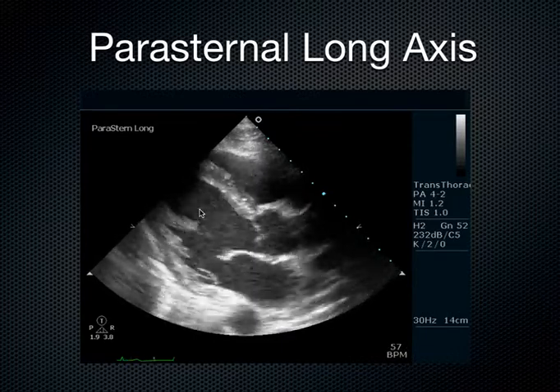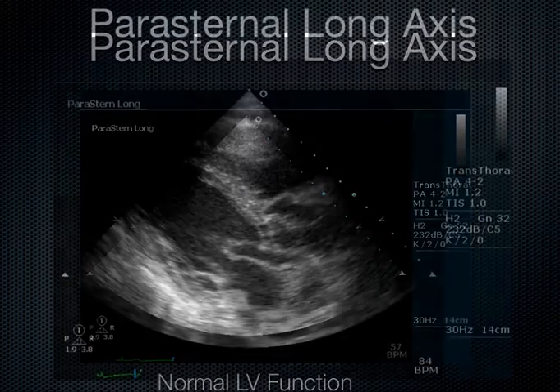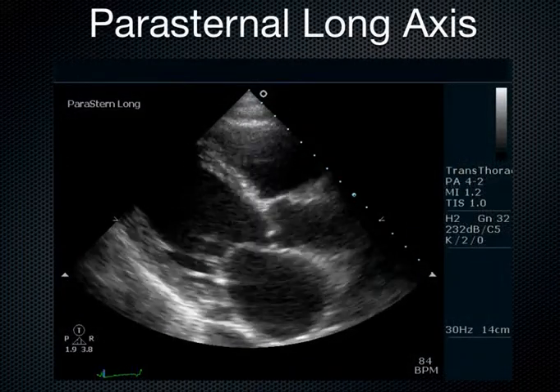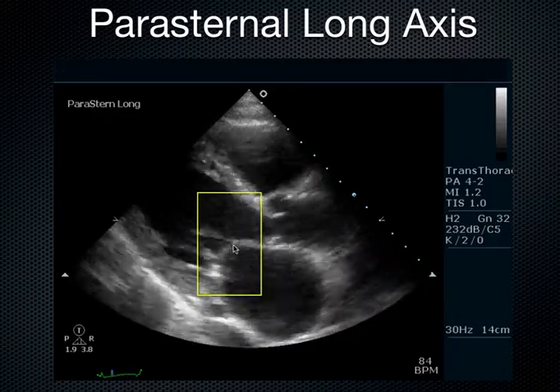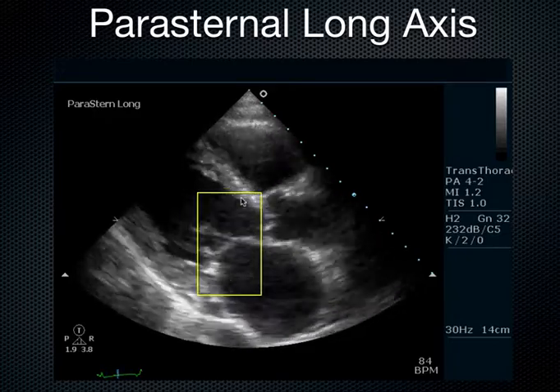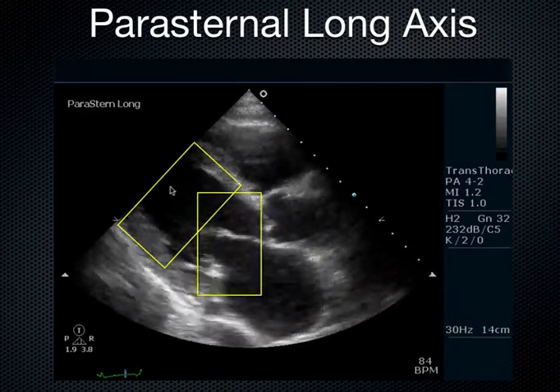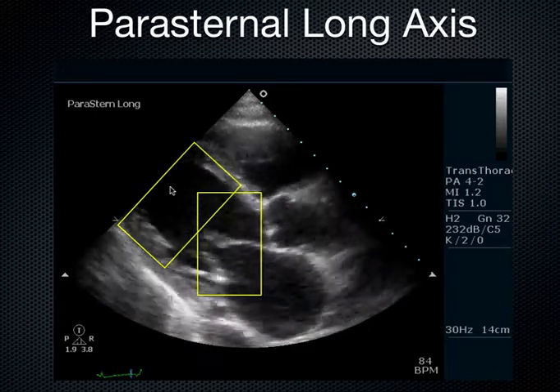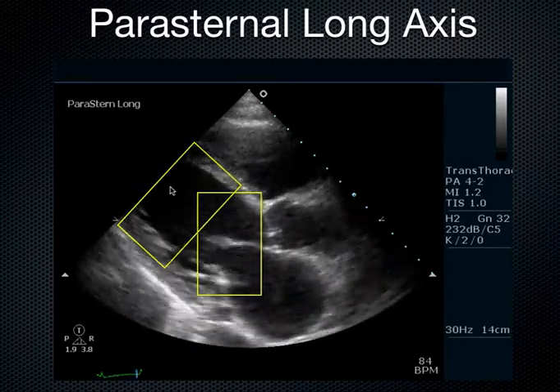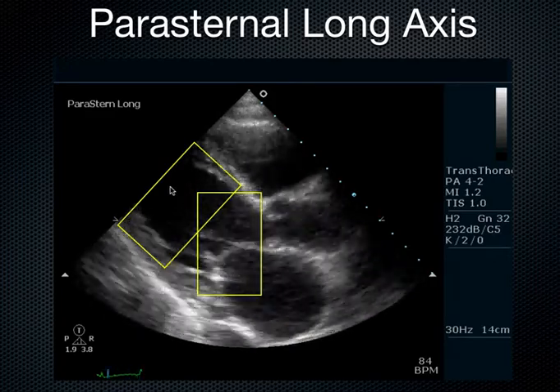So it's easy to put a patient into what we call fluid overload if we don't have a patient with a good functioning heart. Take, for example, this heart. Is the mitral valve coming up and smacking that septum? Nope. What about back here? Do we see a lot of good squeeze here? A lot of delta or change in the chamber size between end systole and end diastole? Nope.